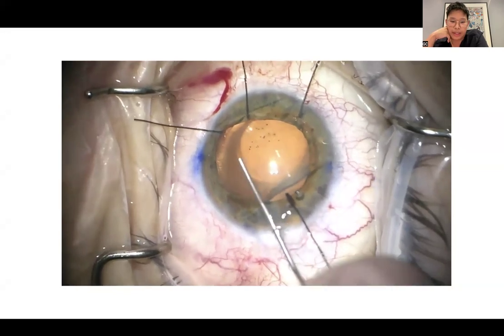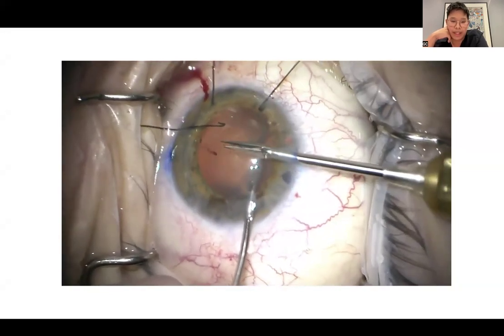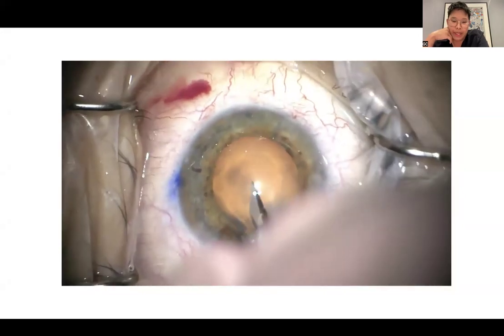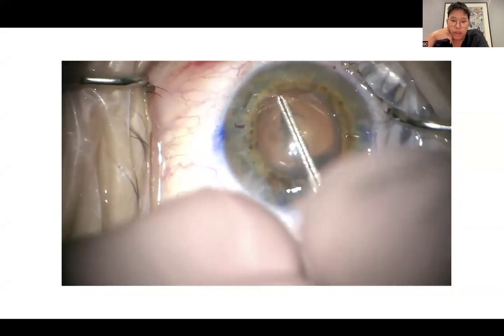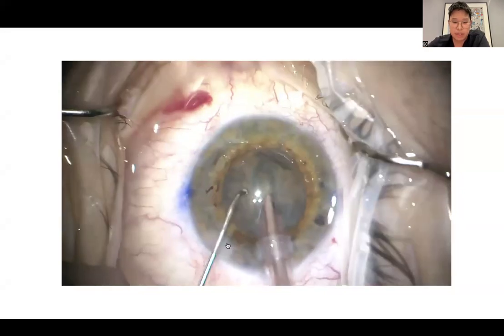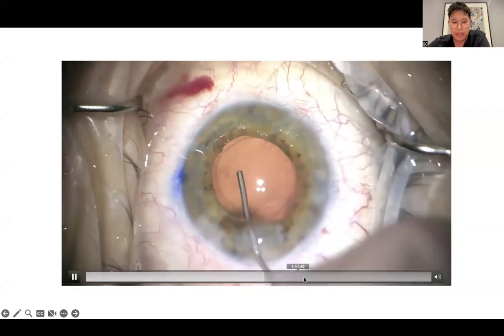Here you can actually see that we're refilling and using numerous amounts of viscoelastic to protect the cornea, especially when the angles are closed and the AC is incredibly narrow. And realistically, if you've got the right Fechner forceps, you can pull the ICL out as a whole. But otherwise, you can then essentially proceed with cataract surgery as per normal. Here you can see that, once again, there is some mild zonular laxity, but the rest of the case goes smoothly. And so here's basically an example of an ICL explant prior to cataract surgery with angle closure.